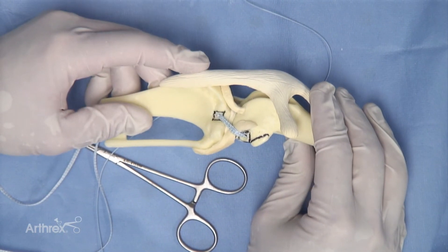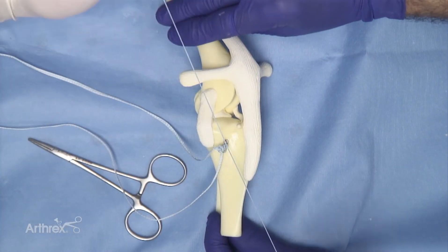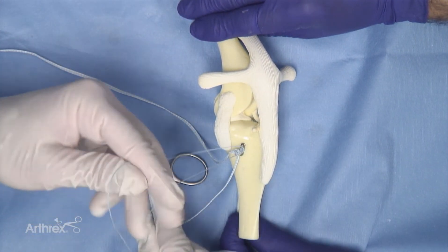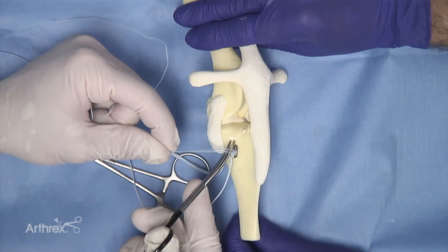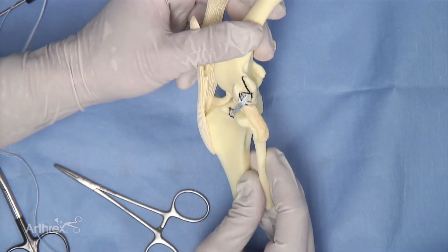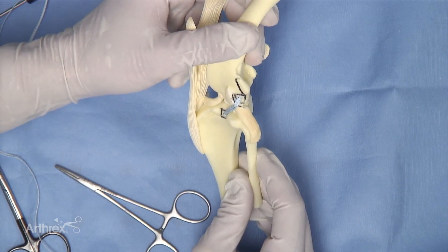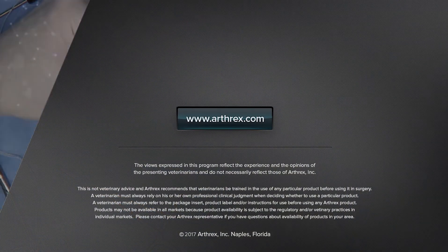It is not necessary to remove the fiber wire; leaving it in position is likely to have little benefit or detraction. If left in position, several more throws can be placed to prevent knot loosening or implant disengagement. The fiber wire is then cut followed by the fiber tape. This knotted swivel lock technique provides another option for placing an extra-capsular suture across the joint to achieve cranial caudal and rotational stability.